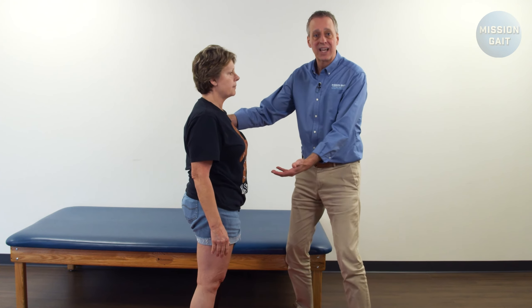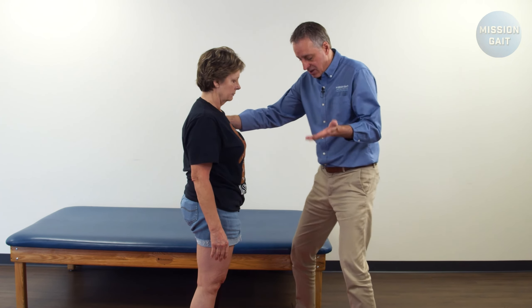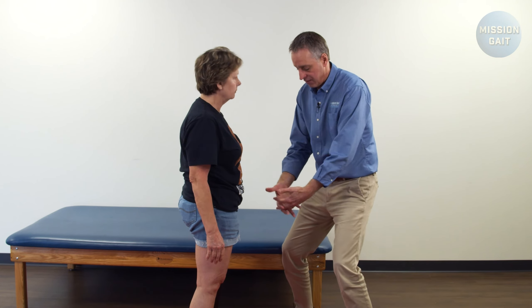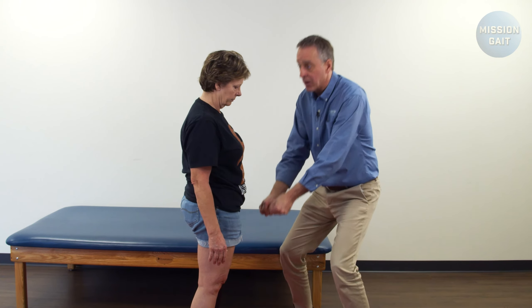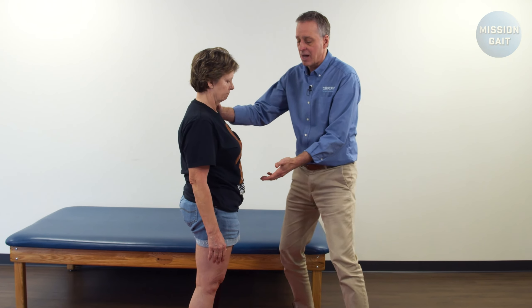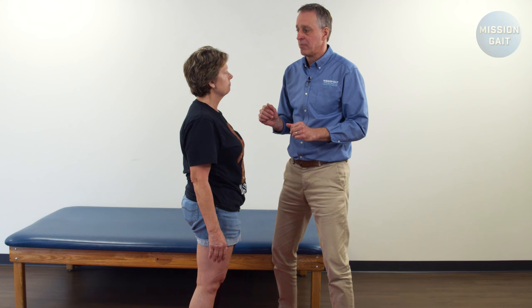Always stay close and hold onto them until they let go of you. Be in a position with your feet apart, knees bent, arms just strong — just be statuesque because they need to kind of crawl up on you. But don't grab her and pull. She's going to control the lift, the entire thing herself. Once she's up, I don't let go of her until she's ready and walks away from me.